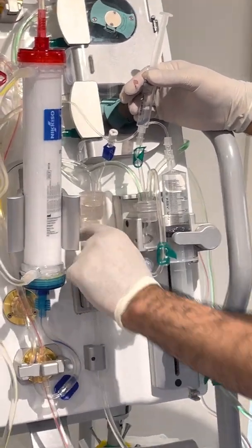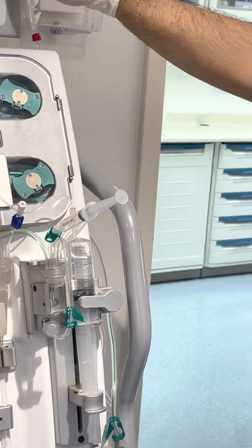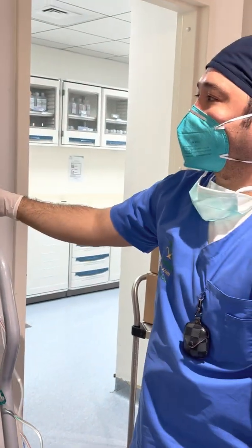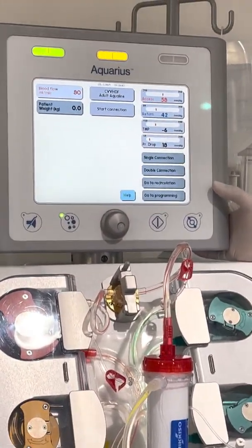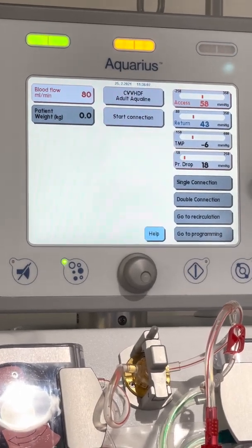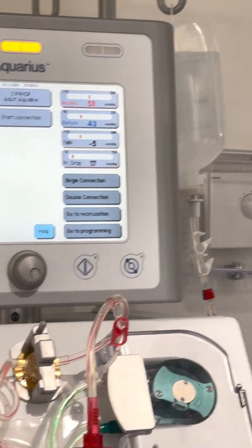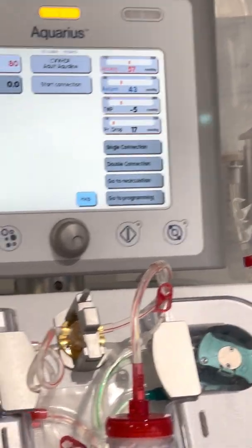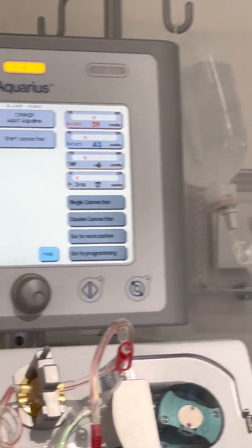So same on this process, but this one is good. So that's it. You just have to choose if it is single connection or double connection. It is applicable when the patient is hypotensive or has high blood pressure. If the patient is hypotensive, of course you have to do the double connection so that there will be no throwing of normal saline or decrease of blood volume. But if the patient is very congested, you apply single connection.